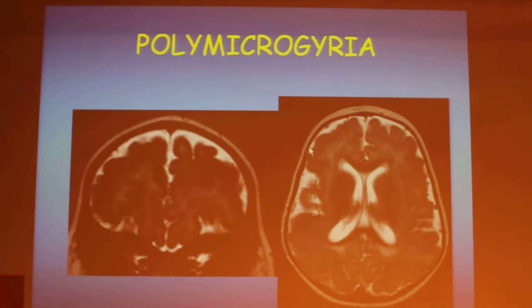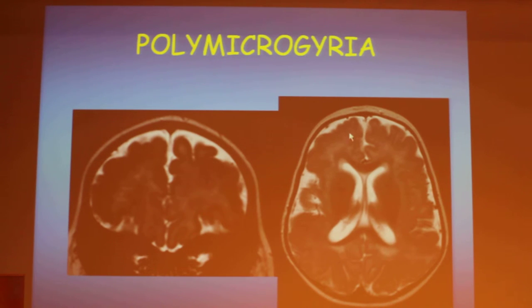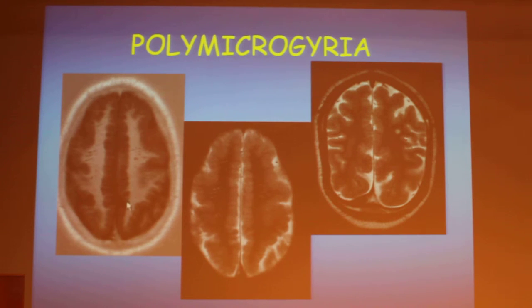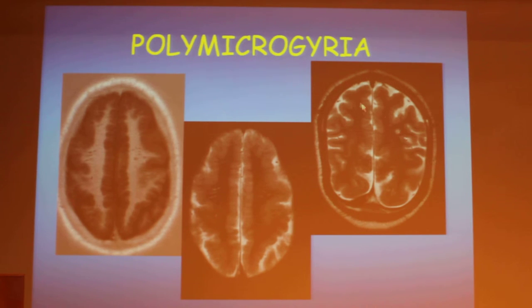It looks like a toothbrush or small villi. In this case it's only in the frontal region, seen nicely on coronal imaging. But it can be diffuse, where every single one of them is a tiny gyrus — with, again, another heterotopic gray matter.